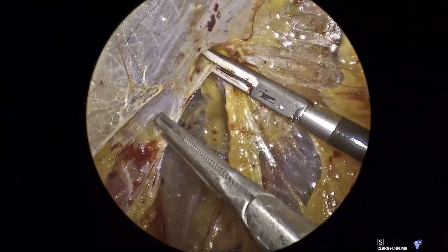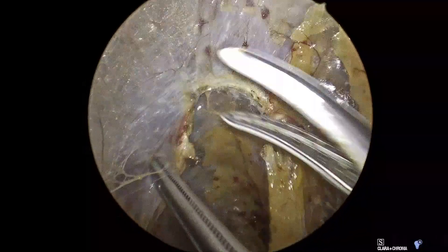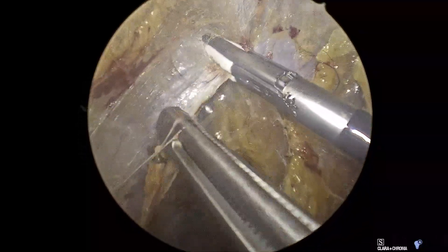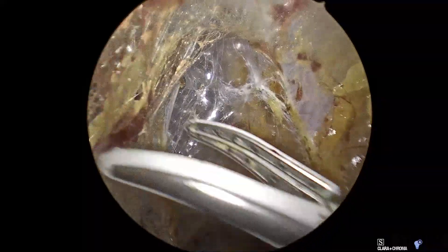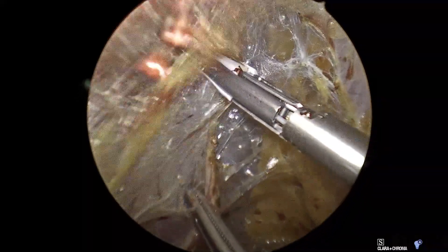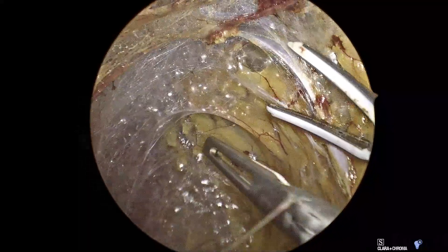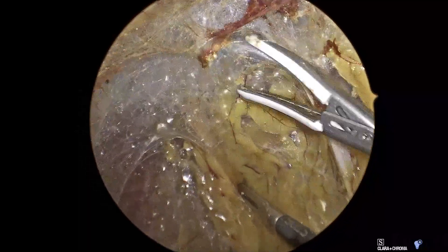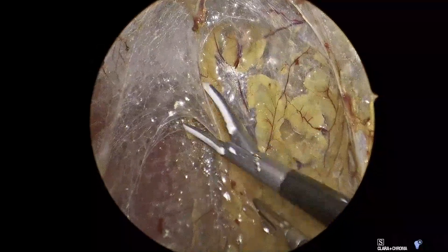Hello, this is Tobias Karling from the Karling Adrenal Center. Thank you for reviewing this video. You will see a completely unedited right adrenalectomy operation. This is a patient with a right pheochromocytoma which was removed in nine minutes. The patient is undergoing a right mini-back scope adrenalectomy. What you see is exactly what happened during the operation. The video is completely unedited and is not sped up.